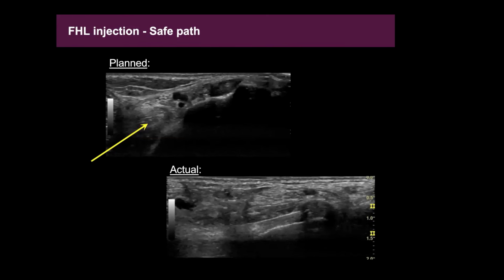You could see on the lower ultrasound image that needle parked right adjacent to that flexor hallucis longus tendon. Often I feel like seeing this in runners and bikers. So that was this patient. I think she was a runner, and we just injected the patient's flexor hallucis longus tendon.